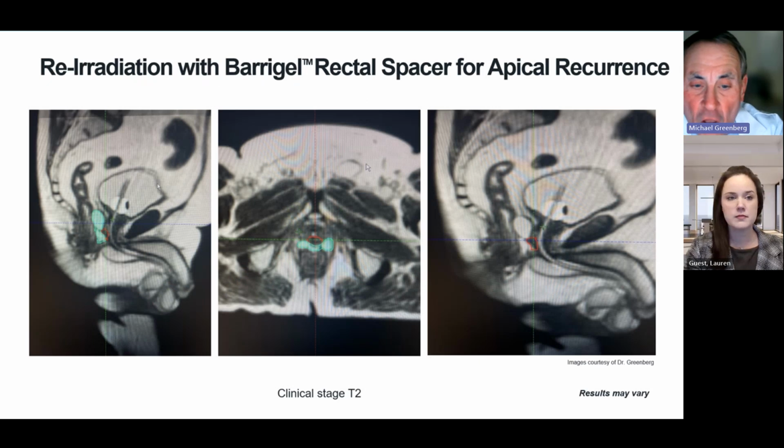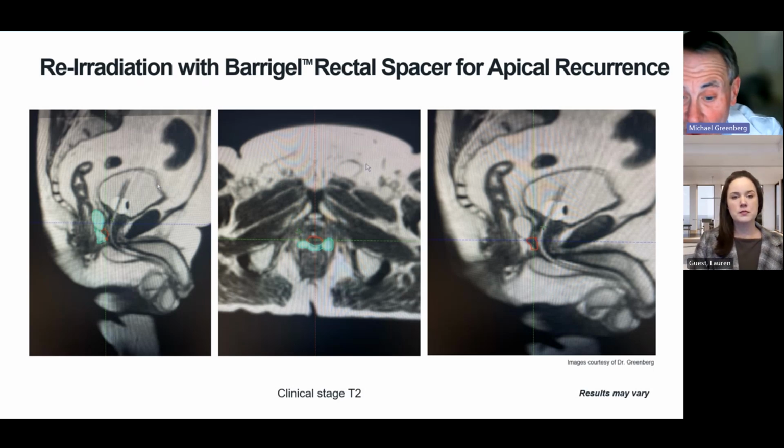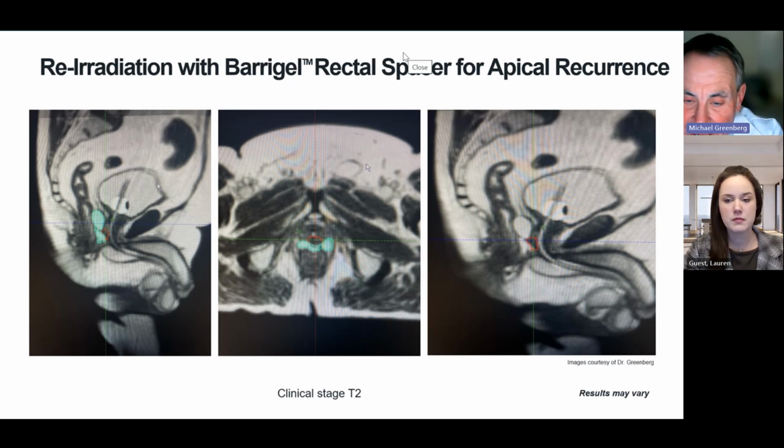Okay. So again, these slides are on an MRI linear accelerator. You do not need to treat these patients on an MR accelerator. I've done them as well on regular accelerators such as a TrueBeam. So here you can see right down at the apex, I was able to get the Barrigel in. You can see that bowing centrally at about 6 o'clock position as the mass pushes down on the spacer, but it definitely gave us a lot of space from the anterior rectal wall to the mass itself, and we still could do urethral sparing. And you can see, the other thing to point out is you can see how much you can get more cephalad towards the SVs. There's lots of room there.